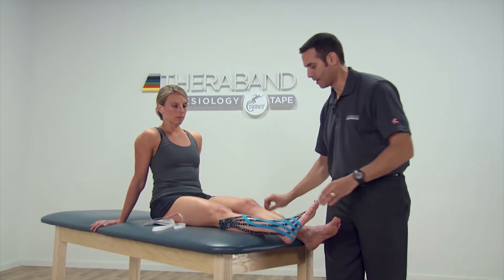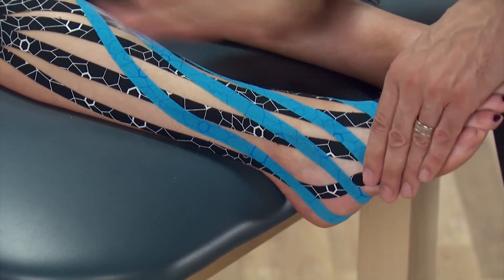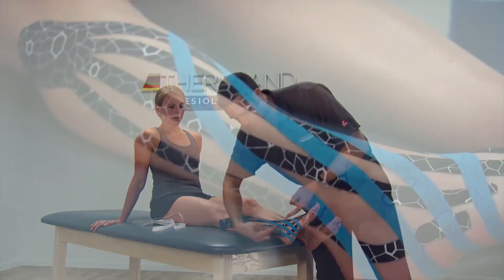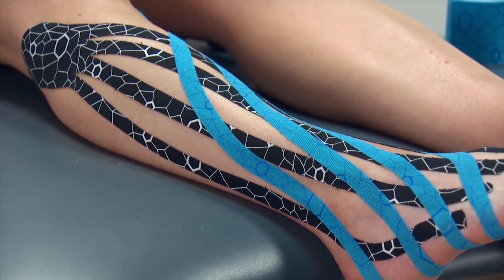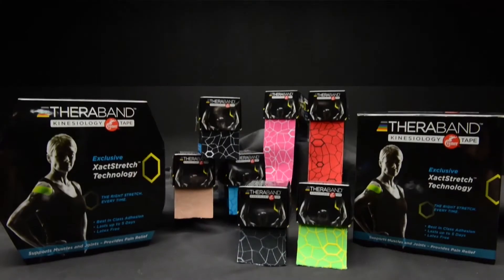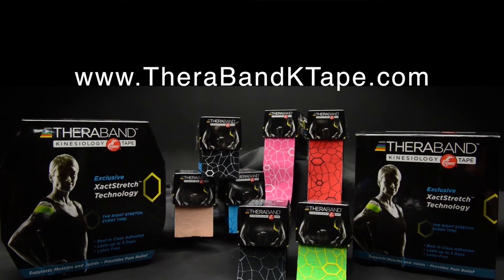Then we can use the backing to activate the adhesive. The important thing here is to see that we get that pie-crust appearance where it will give interlocking different strips from one to the other. For more information and other taping applications, visit therabandktape.com.